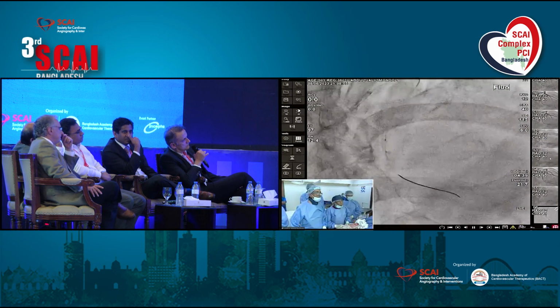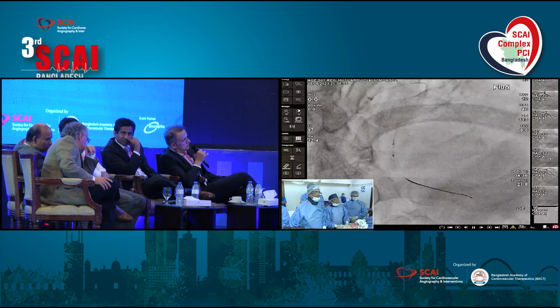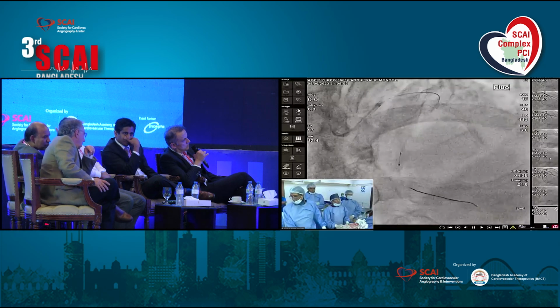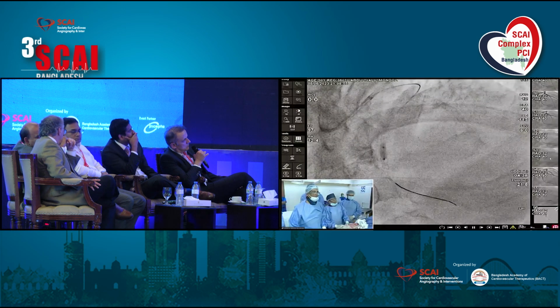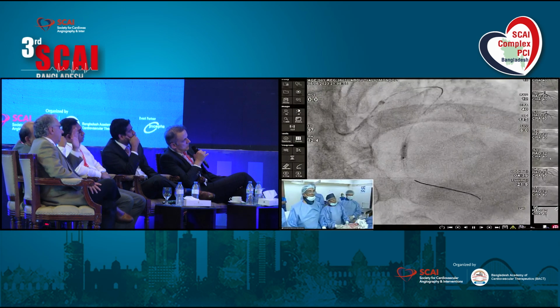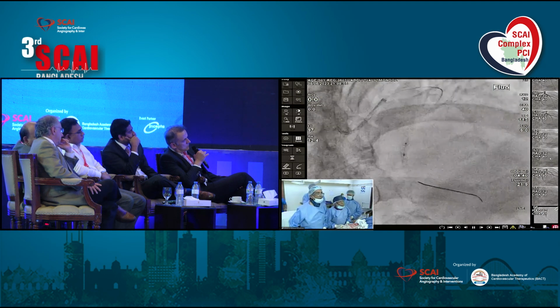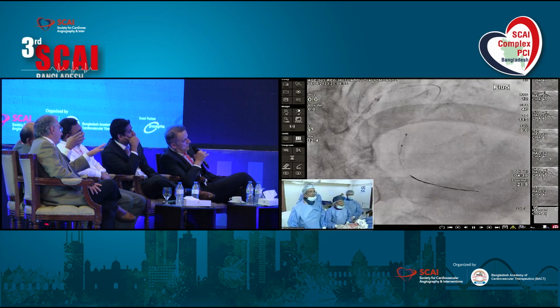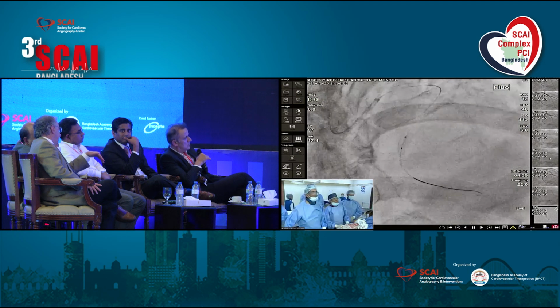2.75. So unless there is a contraindication or risk of HBR, DAPT should be continued for at least 1 year. Yes. 14. Okay, 14. 3.0 balloon and 14 atmospheres. And proximally we'll go to 18, or no, okay, that's good. I want stent enhancement. Stent enhancement, please.